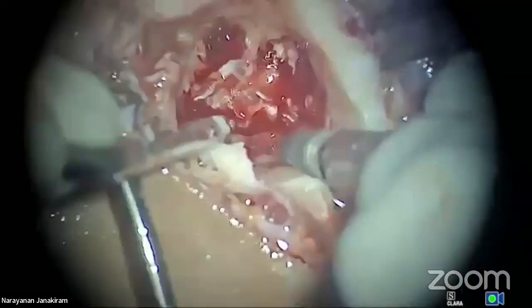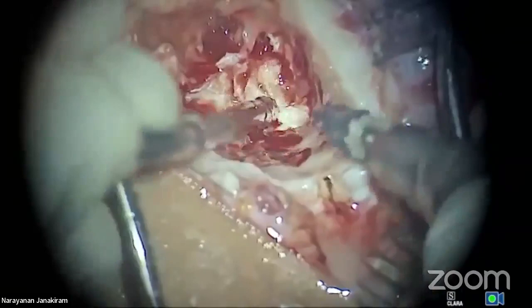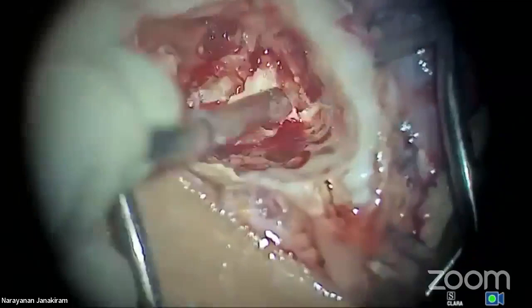Always expose the sinodural angle. And you should all see the kind of exposure. I never went in for revising my exposure. This is very, very important, my dear friends. If you go back to revising your exposure, that means you're wrong. You've done that step wrong. Anything you want to go and revise is a wrong step. See the sinodural angle. Can you see that clearly?